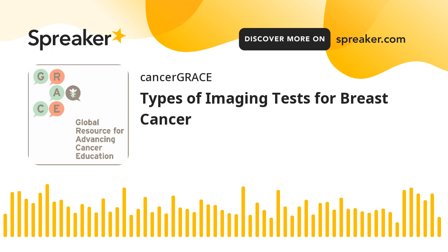The traditional mammograms used to be 2D films. Nowadays, we do have 3D mammograms that are called digital tomosynthesis, and they are becoming quite popular due to a number of reasons. Studies have shown that 3D mammograms, when we compare them with 2D mammograms, may be more helpful in women who have dense breasts. They are more likely to find cancer, and they have less probability of finding false positive abnormalities.